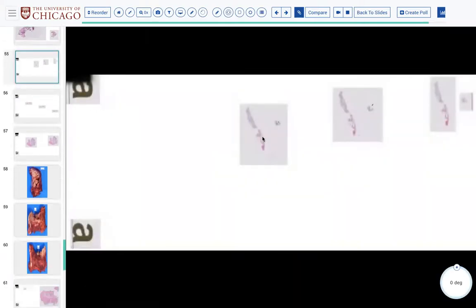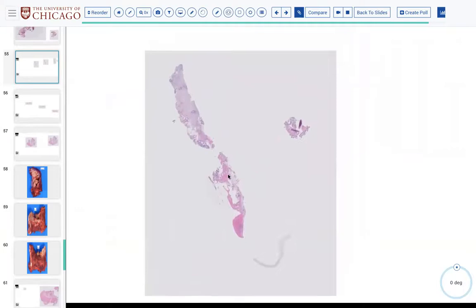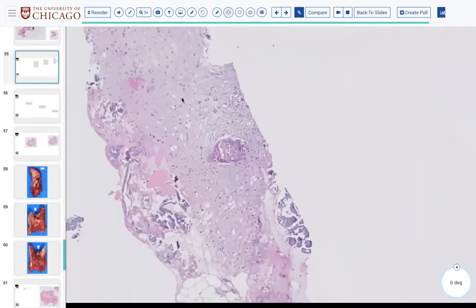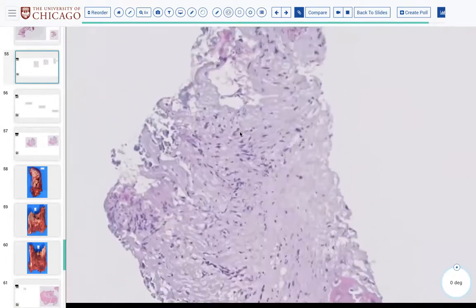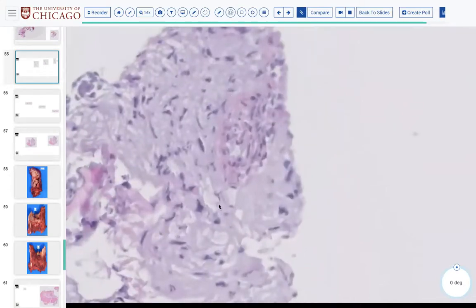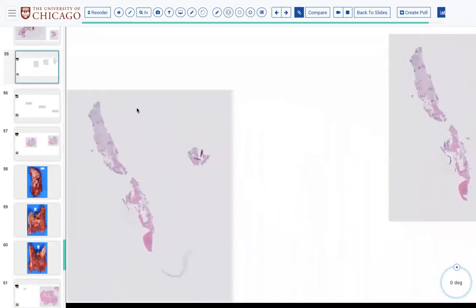So here's the permanent remnant. Here's the permanent remnant. Oh my God, something's still there. Yeah, it looks more convincing. Oh yeah, here it's like involvement, enmeshed. Yeah, this is far more convincing. So blurry, but yeah, you're convinced that that's epithelium surrounded by stroma, yeah? It looks like even a desmoplastic stroma. Maybe a little desmoplastic stroma, I don't know.